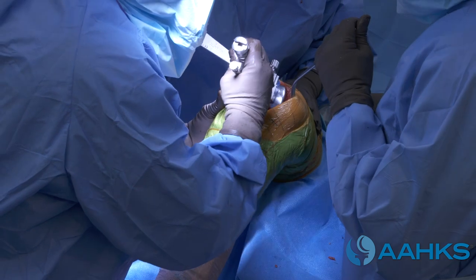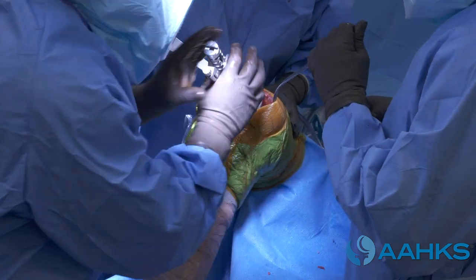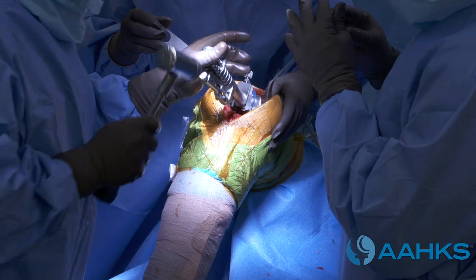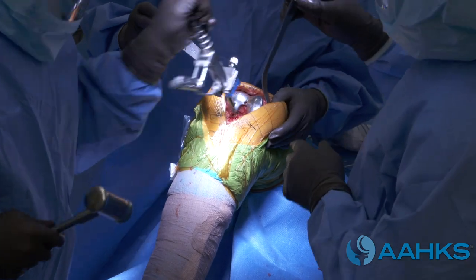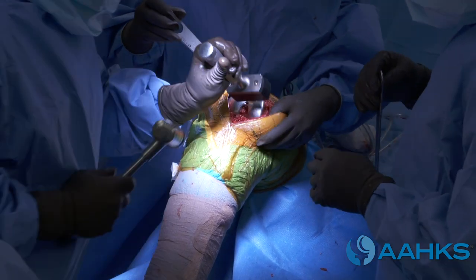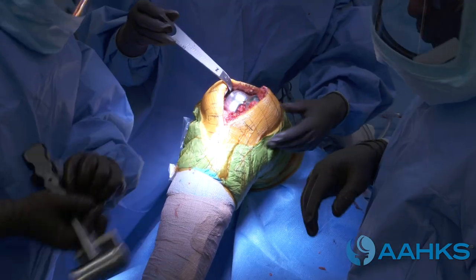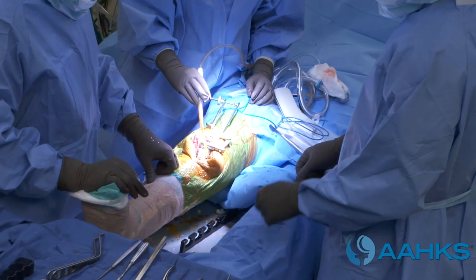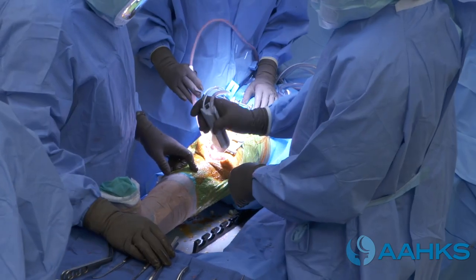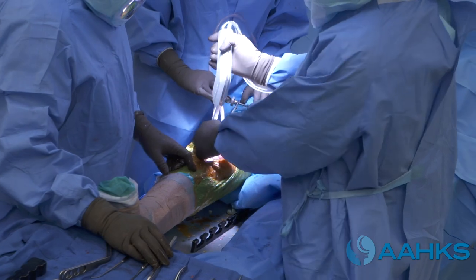When two or more compartments of the knee are severely damaged or worn, this calls for a total knee replacement. The orthopedic surgeon will completely replace or resurface the ends of the thigh bone, shin bone, and kneecap with metallic and plastic implants by affixing them to the bone.